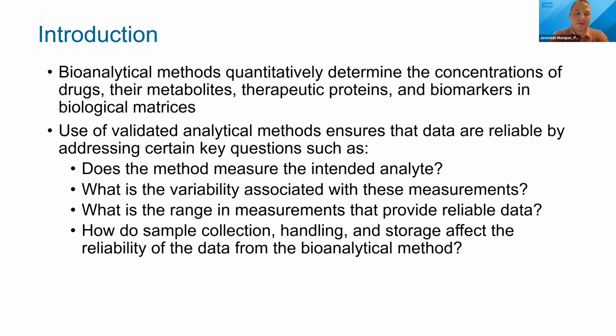And from a practical point of view, questions about how sample collection, handling, and storage could affect data reliability. So basic questions such as how do samples need to be stored, shipped, how long can we store samples and assay them in the future, those types of basic questions.